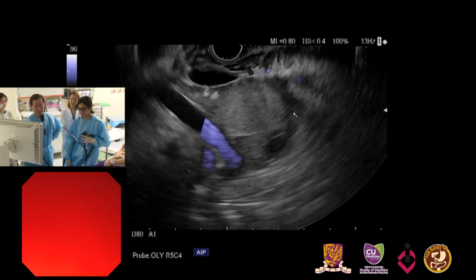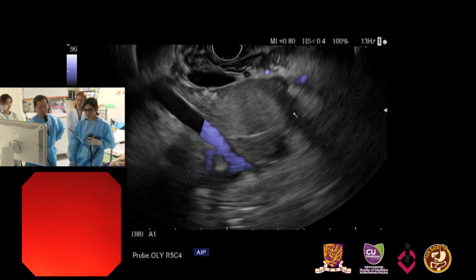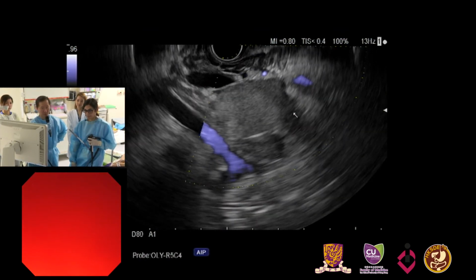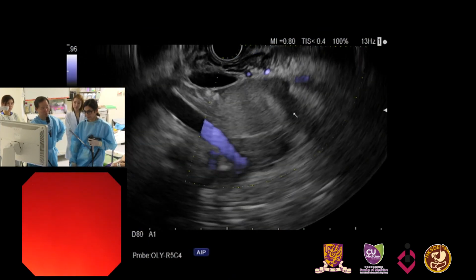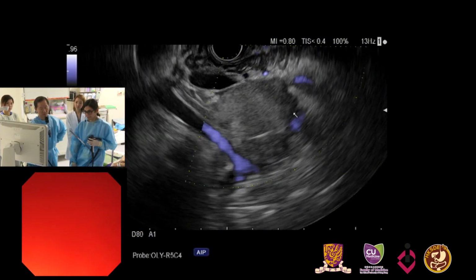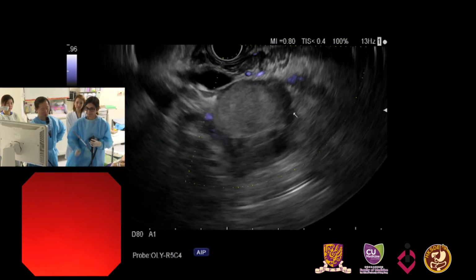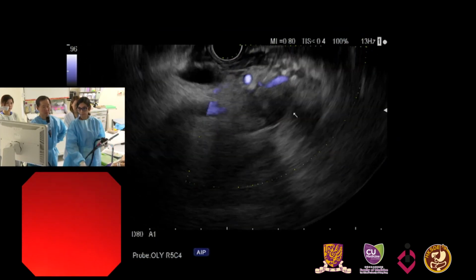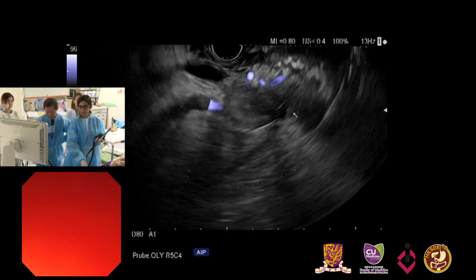We've seen this bleeding with Moray forceps in 2 cases with serous cysts, because these cysts are more vascular. So you see them, but as you saw here, usually the bleeding tamponades itself, but it's a nidus for infection. And patients can have pain afterwards, obviously. Yeah, we did discuss that with the team already, that she will probably wake up with some discomfort.